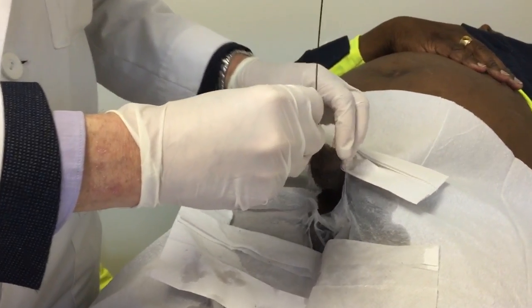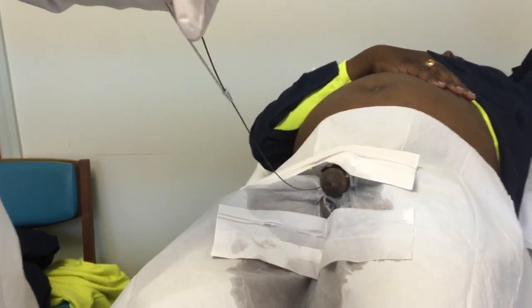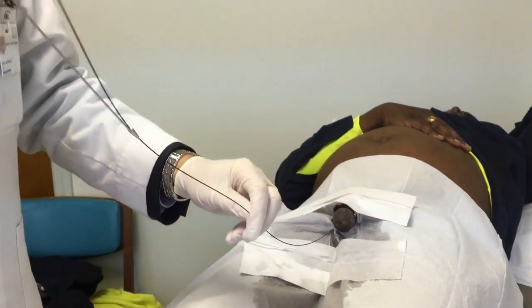With minimal discomfort. And then this is the 8 to the 14, and then the next one will be the 10 to the 20.